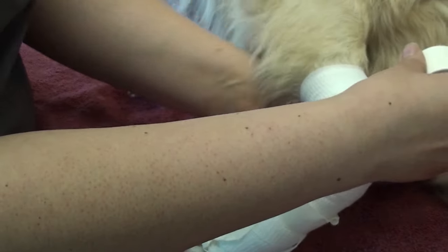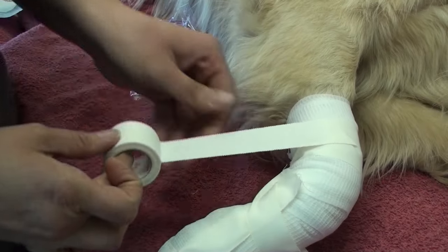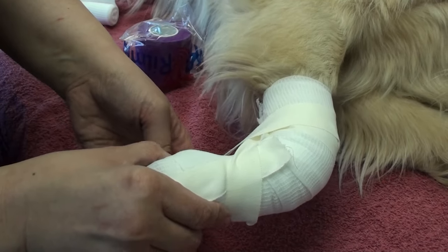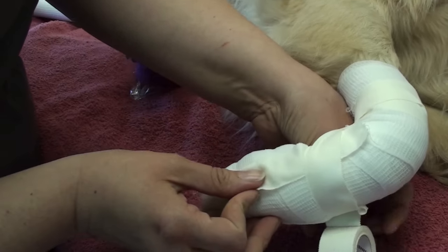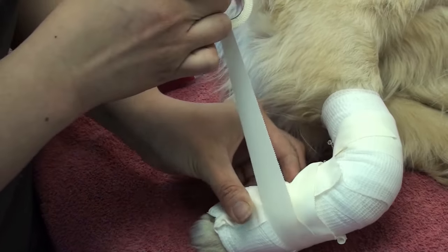Both on the radius and the metacarpal, as she keeps making her loops, she is fanning out a little bit from the carpus itself.